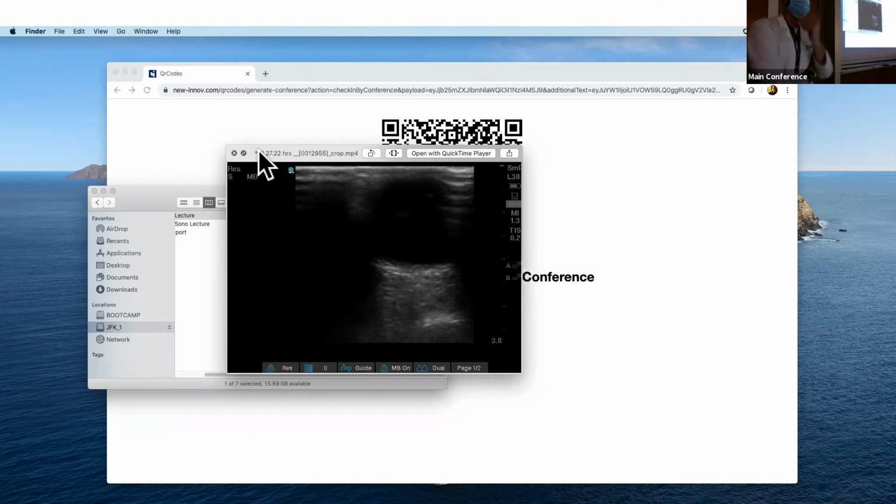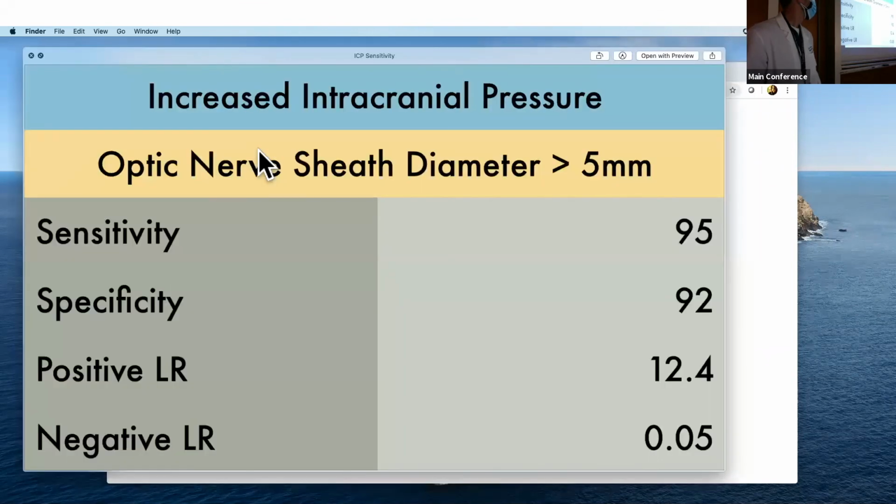Yep. Awesome. Question. For that 95% sensitivity, was that using the 4 measurements, like 2 in each eye? This is definitely a wonderful question, and I would redirect ultimately towards those who are gifted at EBM and literature analysis, because this is really touching on the difficulties of looking at systematic reviews. Now we're taking into account the variances of, well, how many studies have this threshold of 5 millimeters? Okay, the ones that selected out. Within that, how many of those studies use 4 measurements? Some use 3 measurements. They look at one eye, with an ER person who did it with someone else. And I think you really touched on all the different variances that can play into looking at systematic reviews.